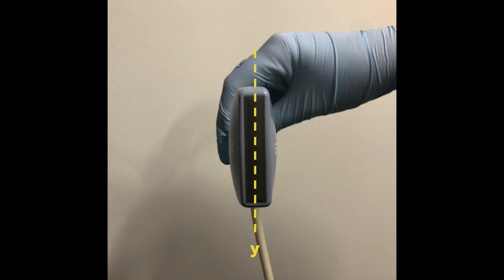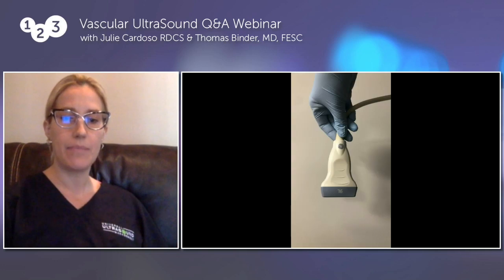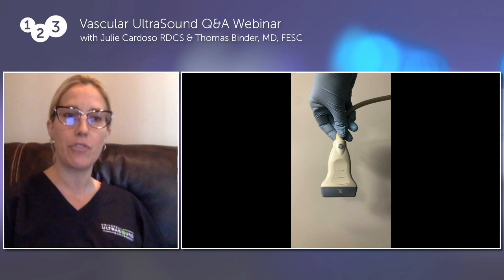So this is the Y. Right, so what I want to refer to is the X and Y axis. We can refer to the long portion of the transducer. So the Y axis is parallel to the long portion of the transducer face, whereas the X axis, you can flip to the next slide, is perpendicular to the long side of the transducer. Then we have the Z axis, go ahead to the next slide, which is the third dimension, which is perpendicular to the transducer face.